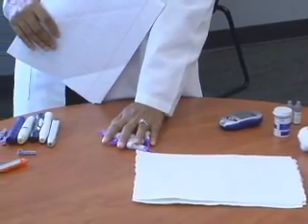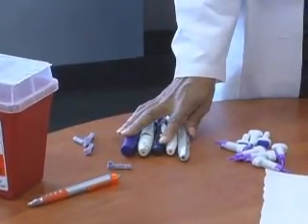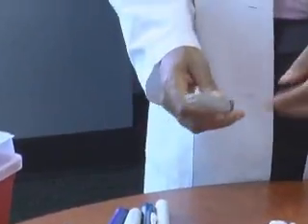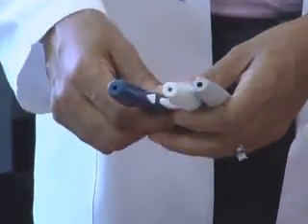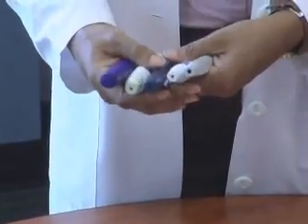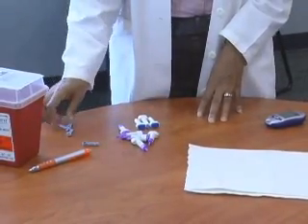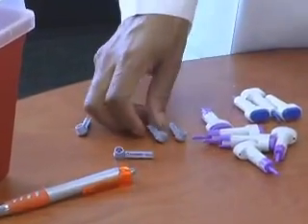You'll want to have some disposable lancets and not reusable lancet devices. These lancet devices are meant to only be used on one patient. You never want to use the type of lancet devices that you sell to your patients to do blood glucose screenings, because blood can get down into the tips of these devices and you could potentially infect another patient and expose them to bodily fluids. So you never use these types of lancet devices for diabetes screenings. You want to use the type of completely disposable lancet devices, or just use individual lancets and dispose of them right after use.